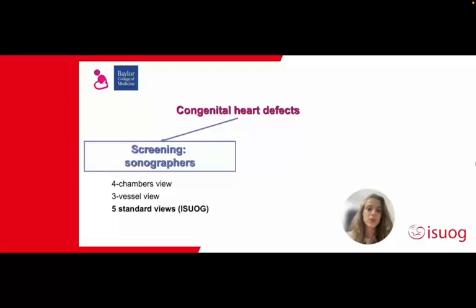very frequent overall. But we have learned over the years that if we want to detect congenital heart defects, we must not only screen high-risk pregnancies, which means pregnancies with a history of heart defect, etc., but we must screen and we must look at the hearts of every single baby. So it must be population screening. And therefore, that implies a lot of resources. We need trained sonographers, trained doctors, and there needs to be a pre-specified program.